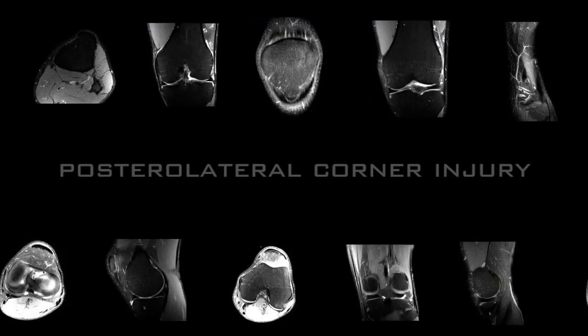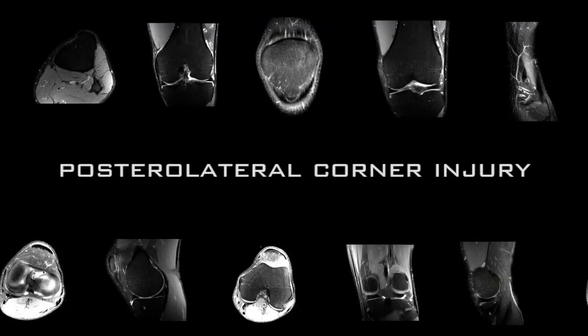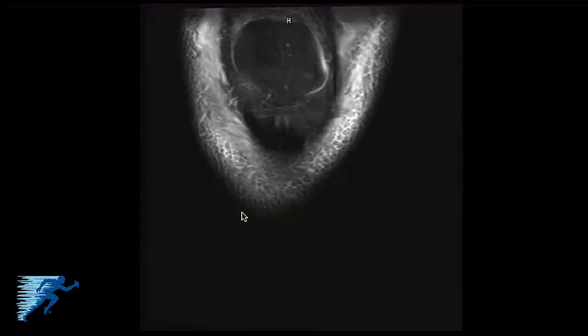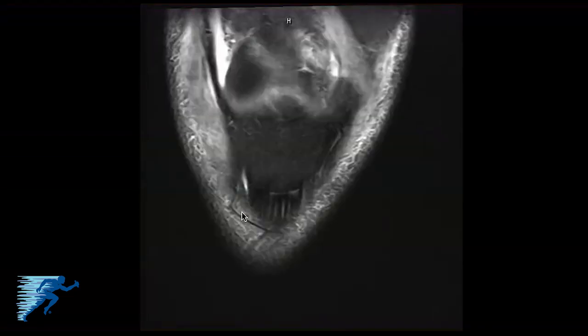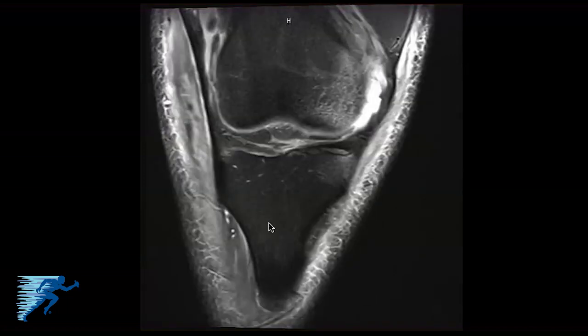I'll go through the different MRI sequences we'd look for with these injury patterns and also some of the secondary signs we'd see with a posterolateral corner injury. Starting with the fat saturation images in a coronal view of a right knee, one of the first things we'll see is some edema in the bone on both the anterior aspect of the medial femoral condyle and the anterior aspect of the medial tibial plateau. This is a common secondary sign of a posterolateral corner injury.